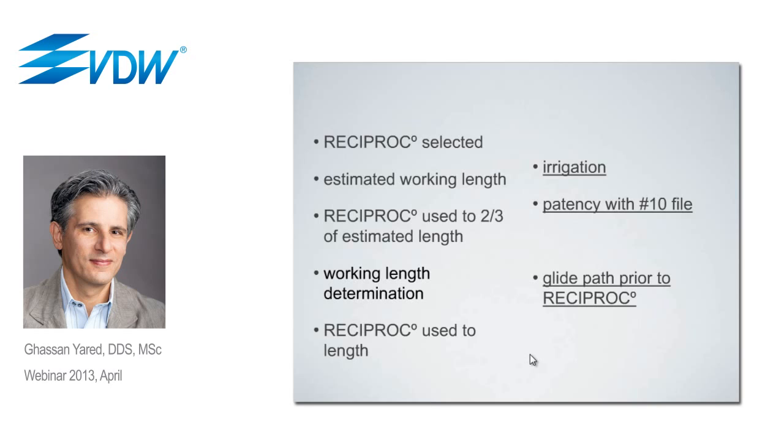We do not over-prepare the canal in the coronal third to obtain this straight line access. And this is very important as far as the prevention of vertical root fractures is concerned. So it is a conservative way to obtain a straight line access.